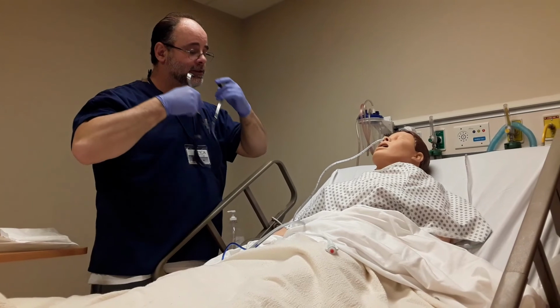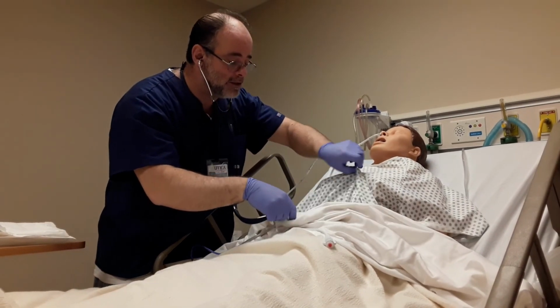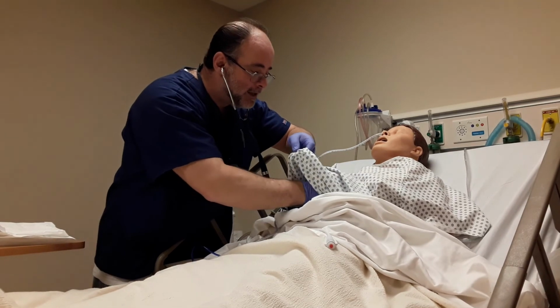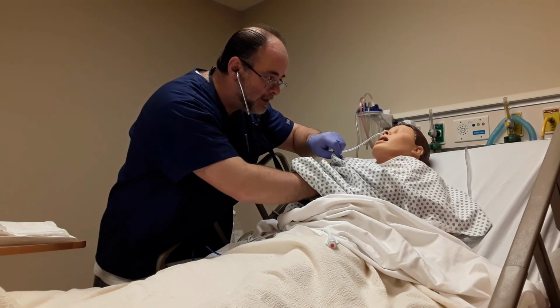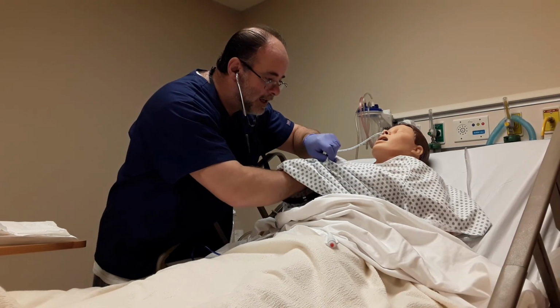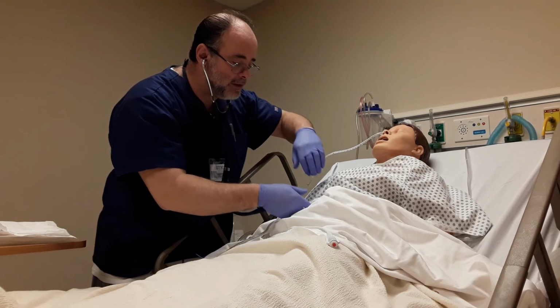Again, I can auscultate lung sounds as well. There's another identifier. So Mr. Green, please take a deep breath in and out. Okay, in and out. And lung sounds were clear before, lung sounds are clear now.